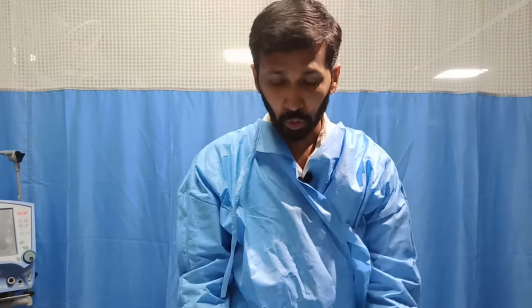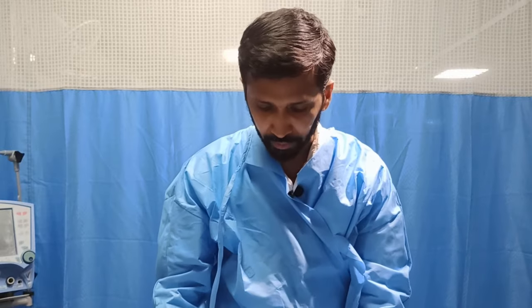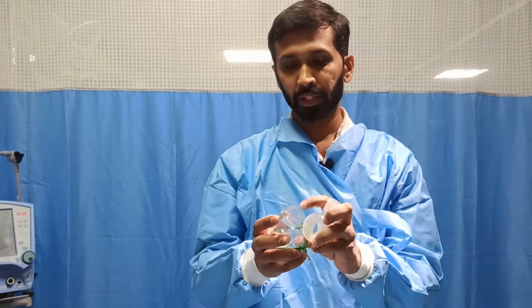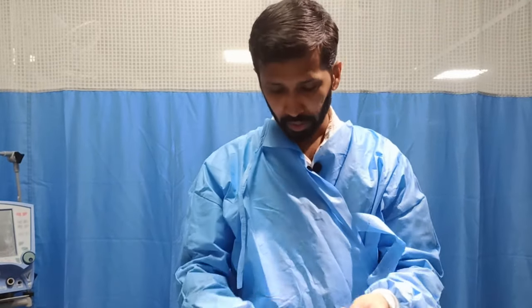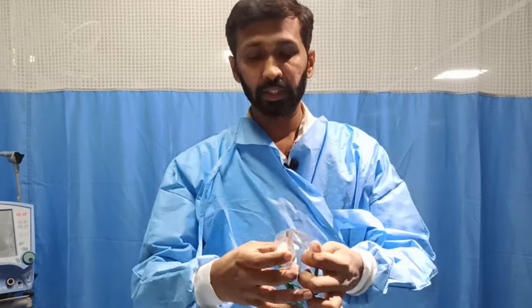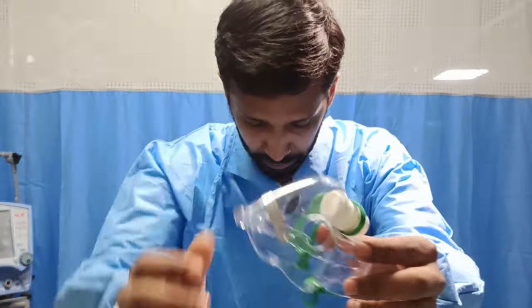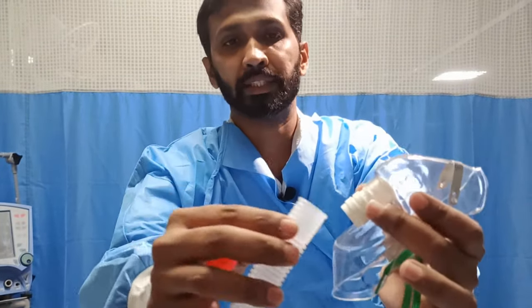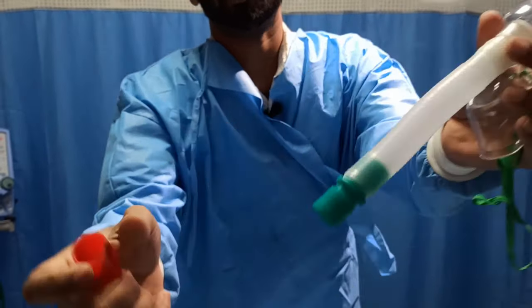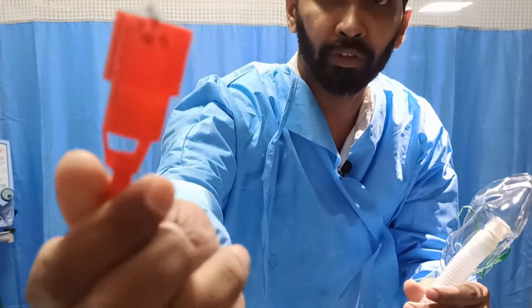The next step is the venturi mask. The difference with the venturi mask is that here we can precisely determine the FiO2 that it delivers. A venturi mask consists of, as usual, a tube with, this is the venturi mask. This venturi mask is connected with this extension. So this is the venturi device that is usually used here.